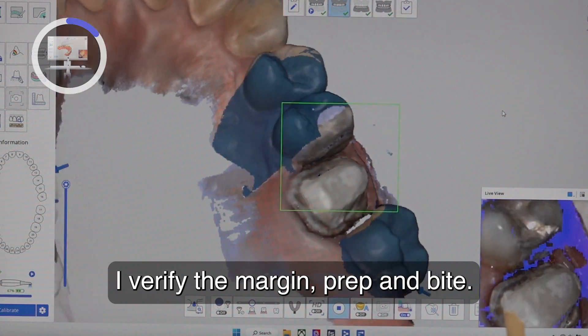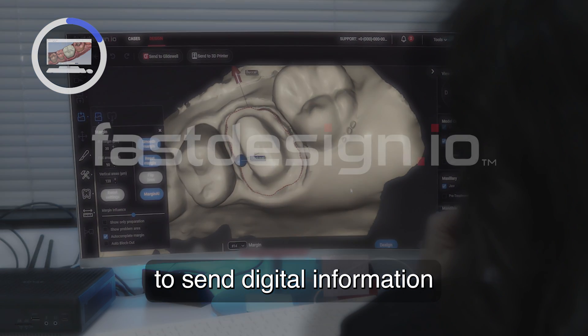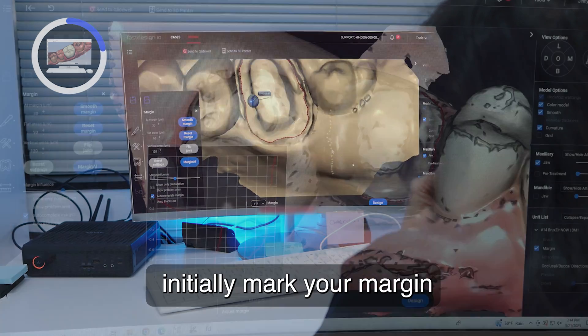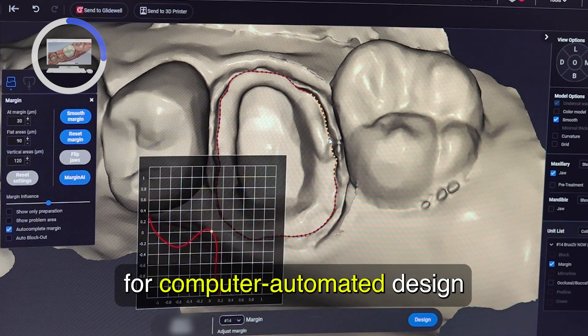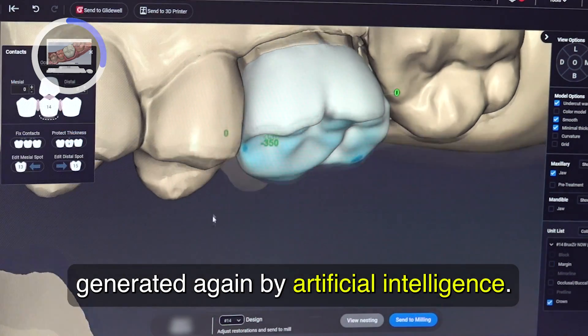When the scan is complete, I verify the margin, prep, and bite. The scanner is seamlessly paired to send digital information from the FastScan to the FastDesign software. Artificial Intelligence will initially mark your margin, and as soon as I recheck and confirm the margin, I click Design for computer-automated design generated again by Artificial Intelligence.